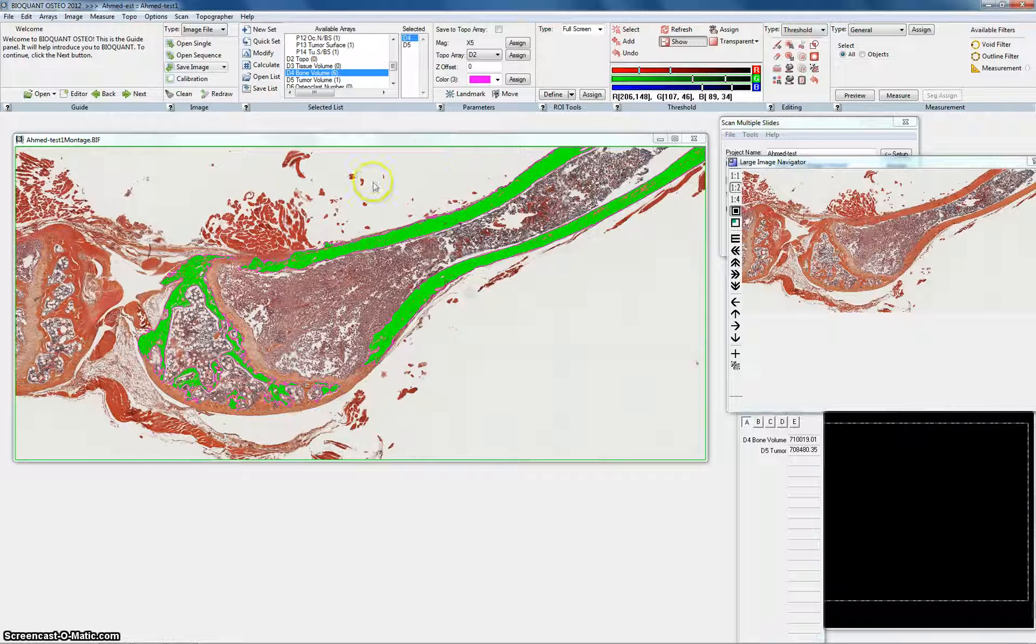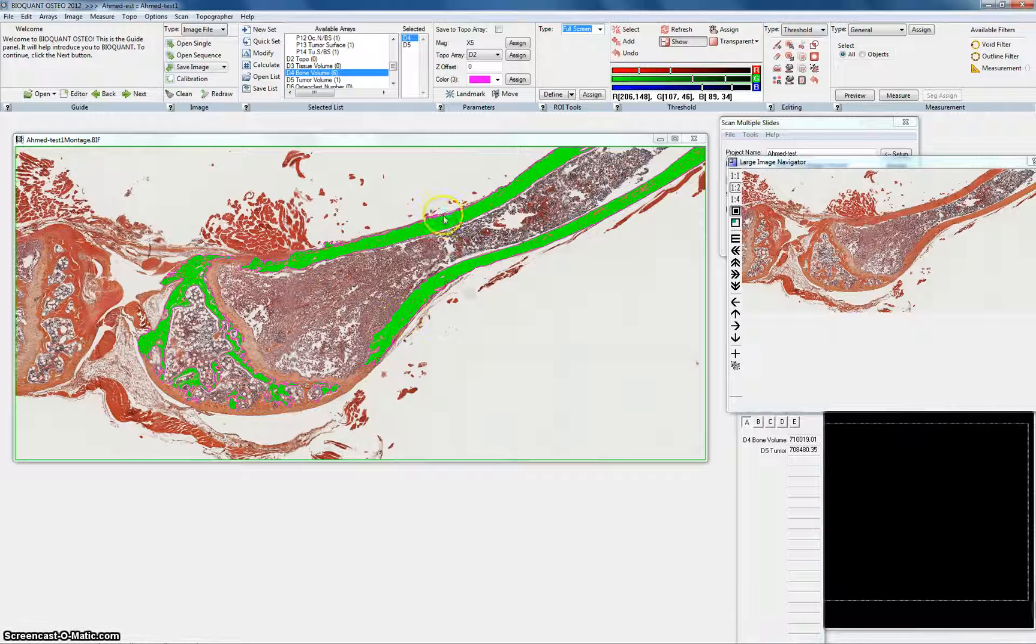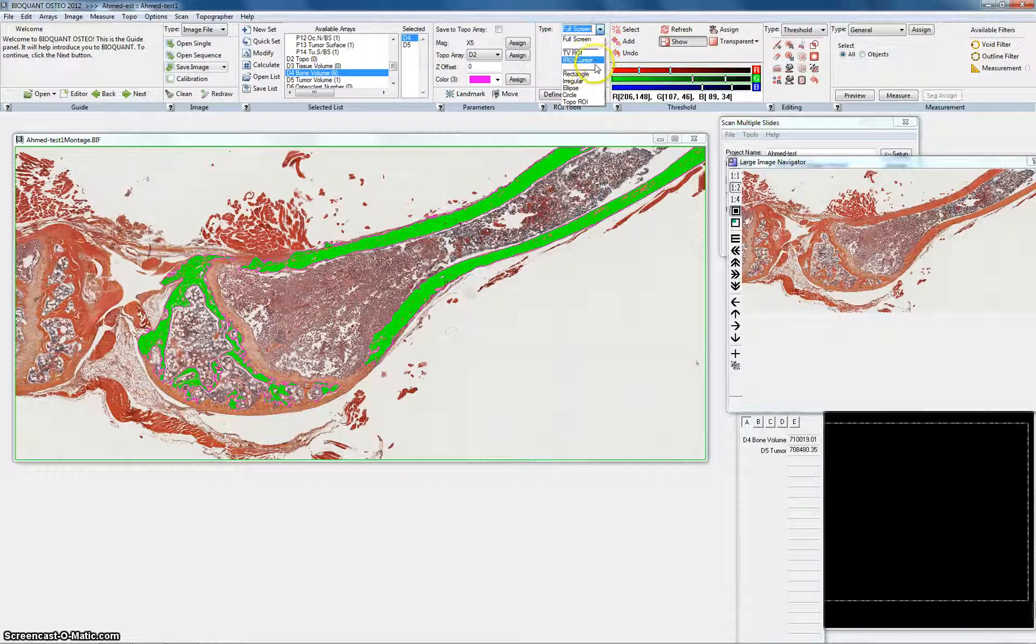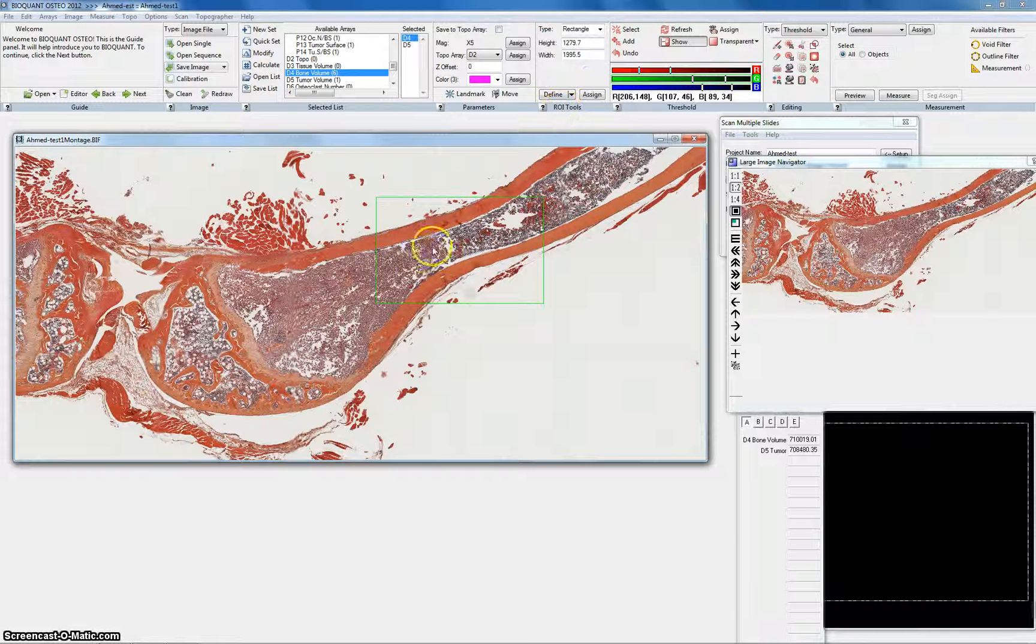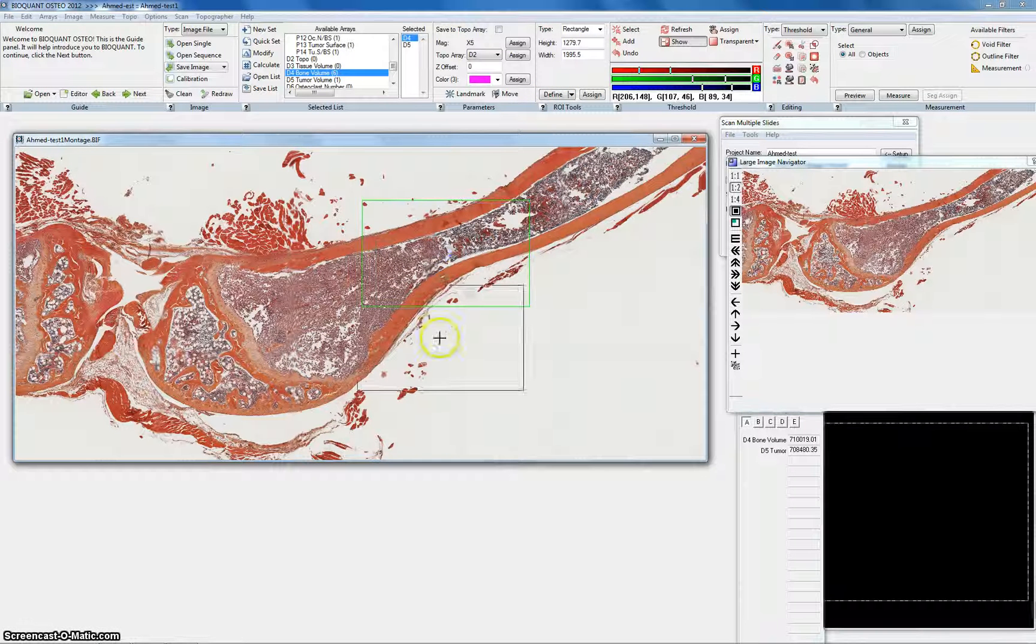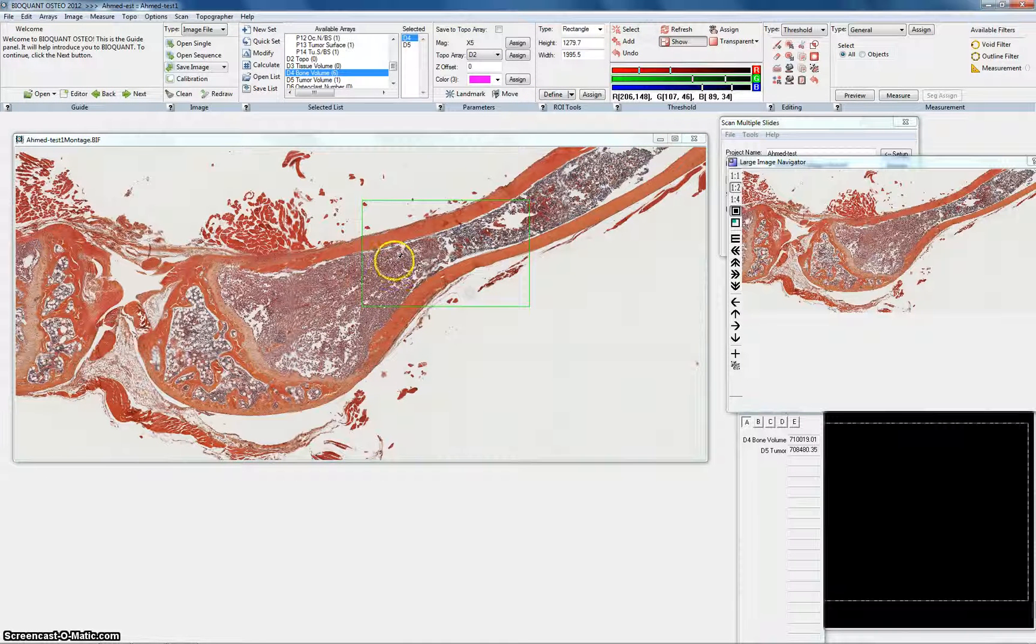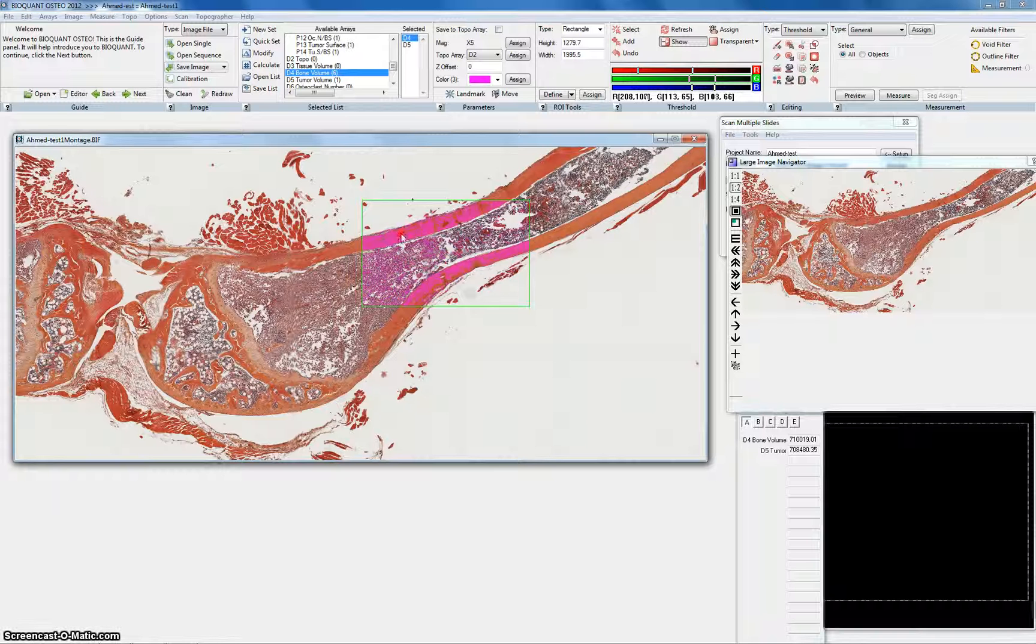You could adjust the measurement field instead of full screen. You could make it a rectangle. You could make it an irregular shape. You draw it yourself. You could make it a circle. Like if you want to measure only a certain part of bone. Like this part only. Like this rectangle. So you hit rectangle and you define it to this part only. Now it's going to choose the bone only in this rectangle. Nothing else. So it's up to you.